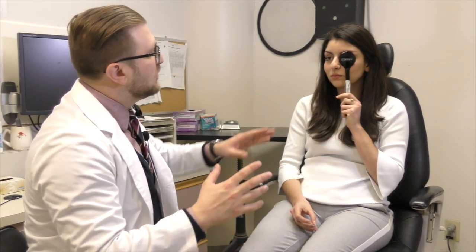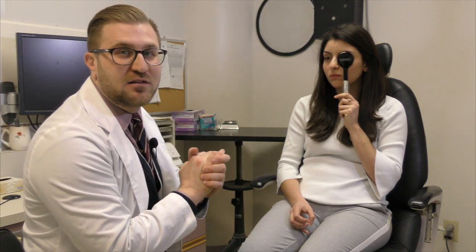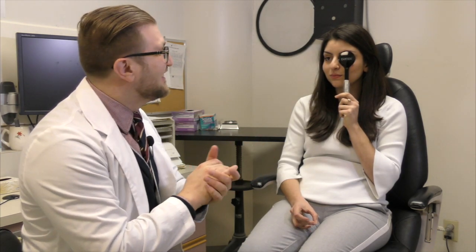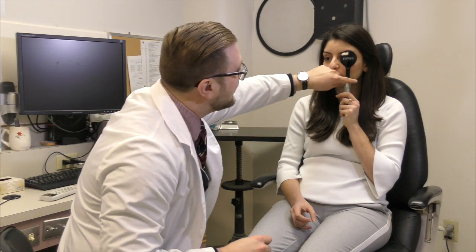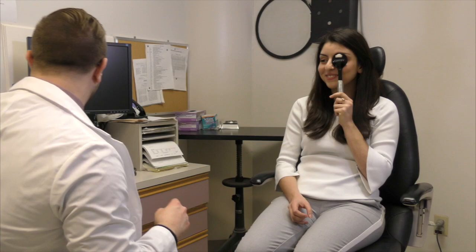Cover your left eye, please. She's covering her left eye and looking through the right eye. It's very important to make sure the patient is not cheating. Often patients will try to peek through, especially if they don't see very well in the other eye. This is especially important in the pediatric exam — children like to cheat and will always try to cheat you. She's peeking a bit, so I'm going to push it over like that. No peeking, please — don't cheat on this exam.